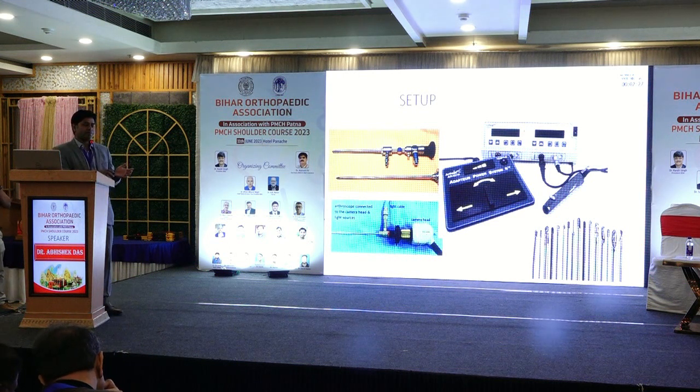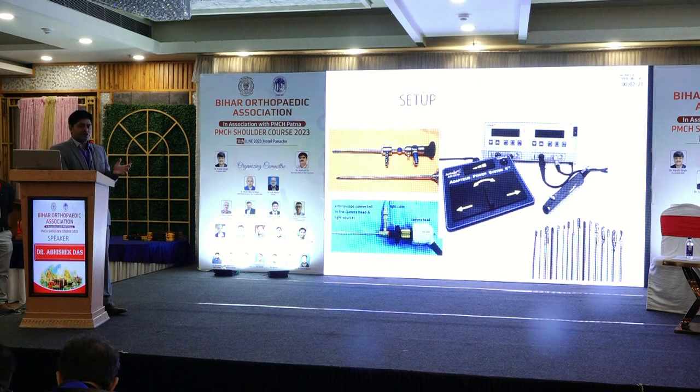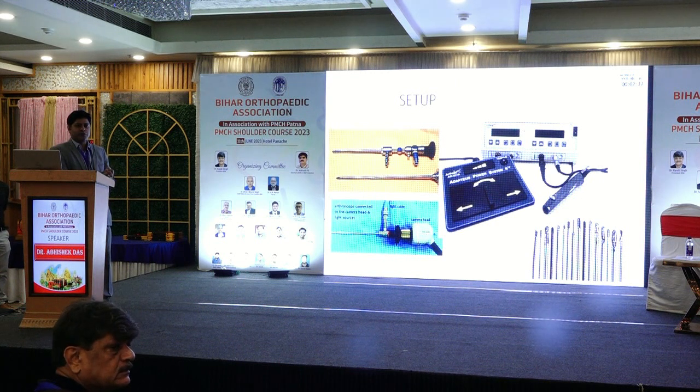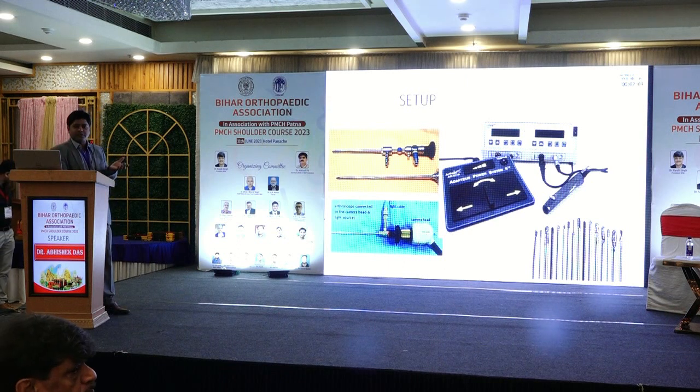Now, in shaver, you have to be very careful when you are purchasing your equipment, because the cheaper versions will have a very heavy handpiece. And say if you are doing it in lateral decubitus, you will find that your hands are like this, and slowly you will start getting tired if your handpiece is very heavy.